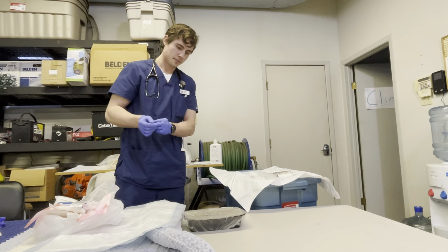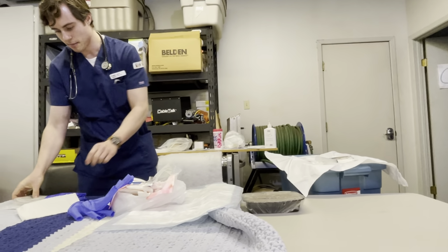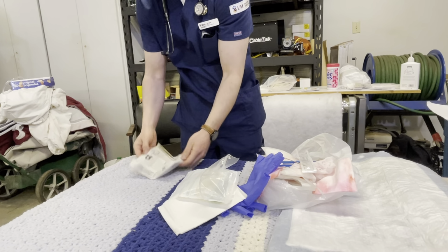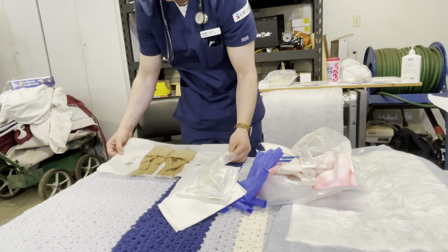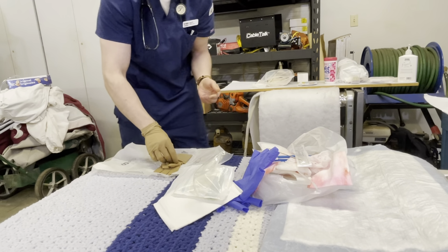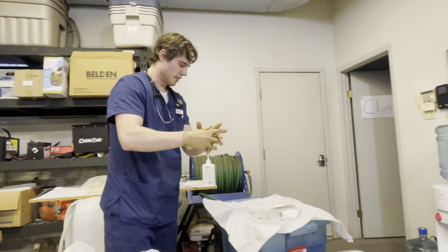Signs of healing. I'm going to now take my gloves off, throw those in the garbage. I'm going to do hand hygiene. And I'm going to now put on my sterile gloves at the end of the bed. I asked the patient and they said that that's okay. So I'll open up my sterile gloves here. I'm going to put on my right hand. There we go.